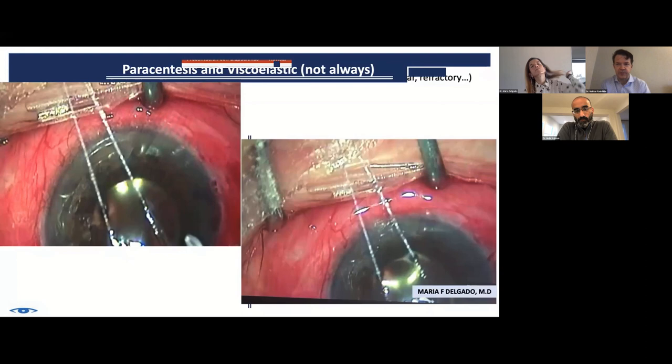Yeah, so I'm very similar in practice. I don't leave quite as much in. I was a little bit surprised when I was first starting out with tube surgery on the variability.